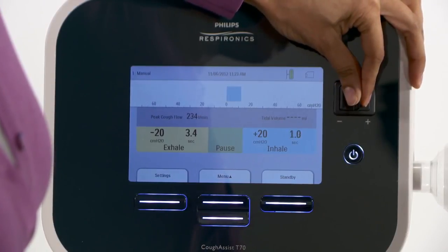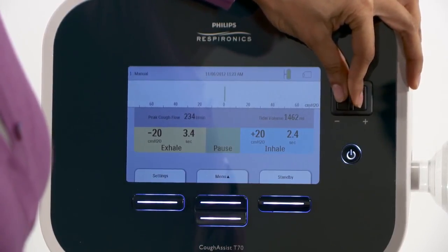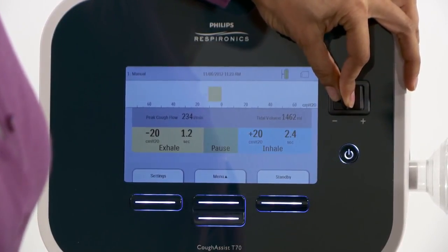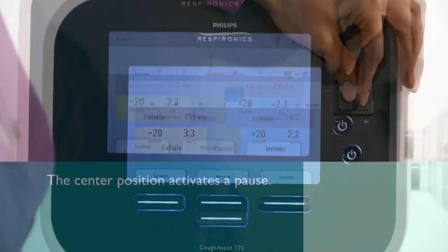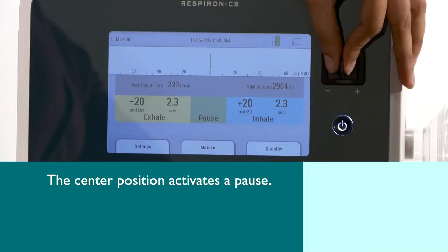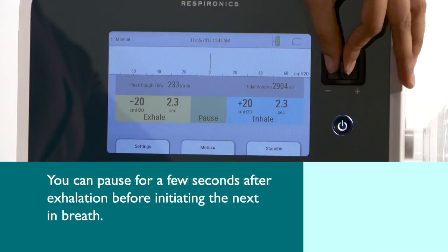When providing a treatment in the manual mode, you can see how long you are delivering the inspiratory pressure and how long you are delivering the exhaled pressure on the screen. The center position on the lever activates a pause. Depending on patient preference, you can pause for a few seconds after exhalation before initiating the next in-breath.